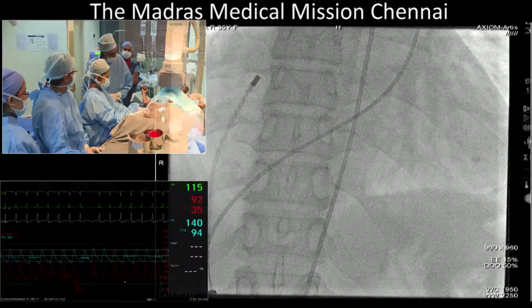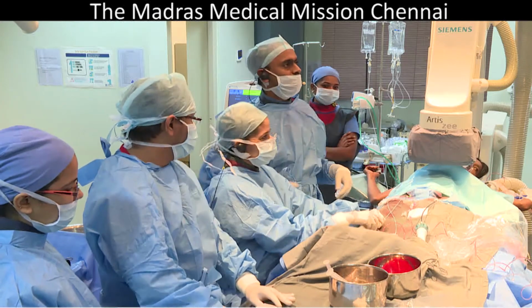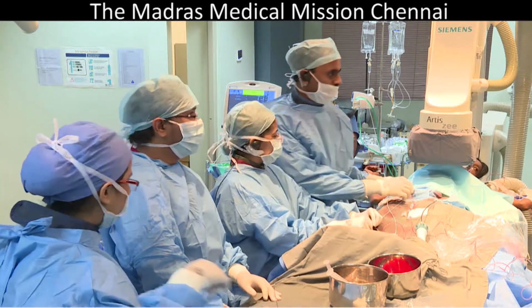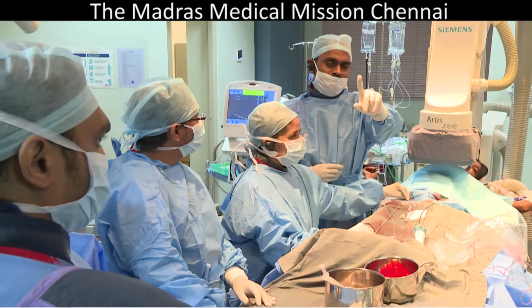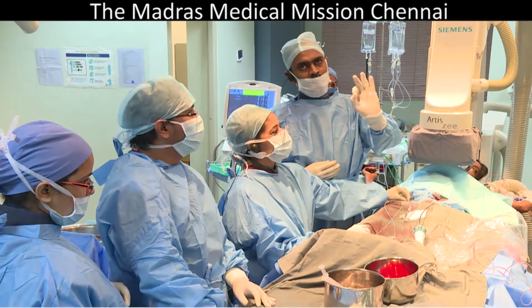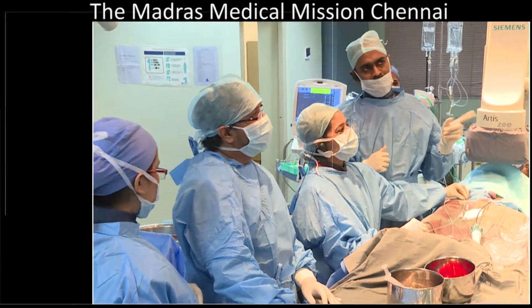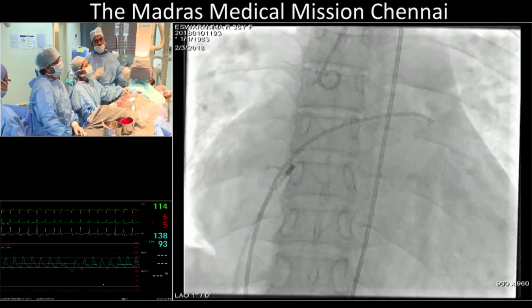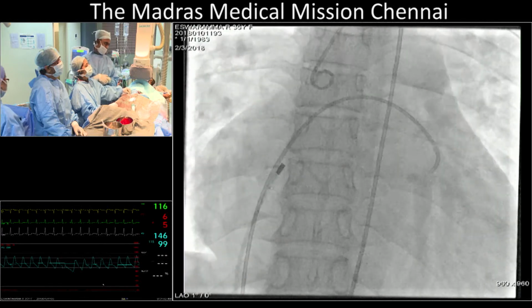But this is controversial in many ways, isn't it? As shown by the show of hands, it's 50-50. You know, you're not going to listen to guidelines, or physiology is not democratic. No, Zahid, let us make it clear. On what guideline are you stating that you want a complete closure of this ASD when the pulmonary artery pressure is not showing any reduction? Shiva, don't shout. Turn the volume down and then carry on.